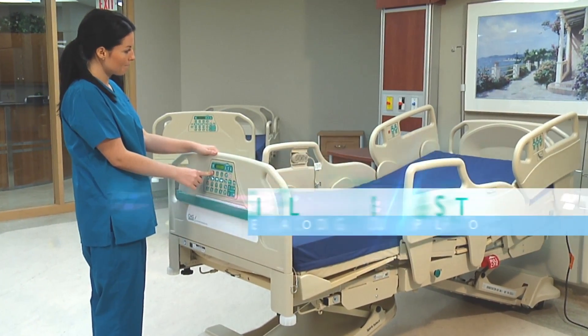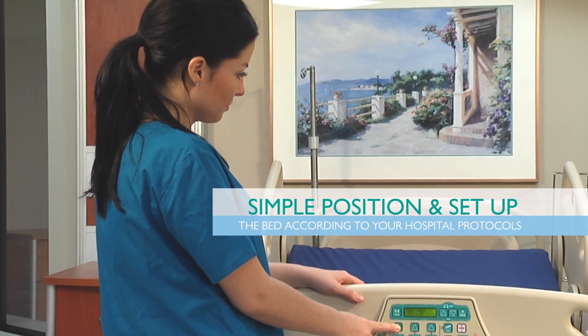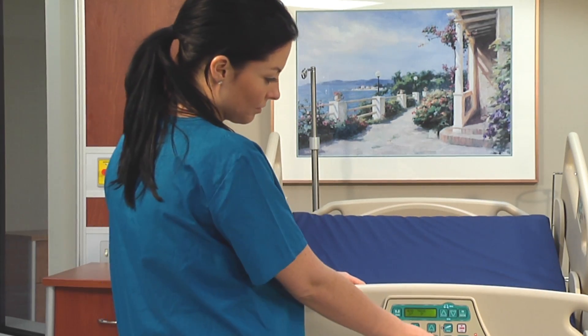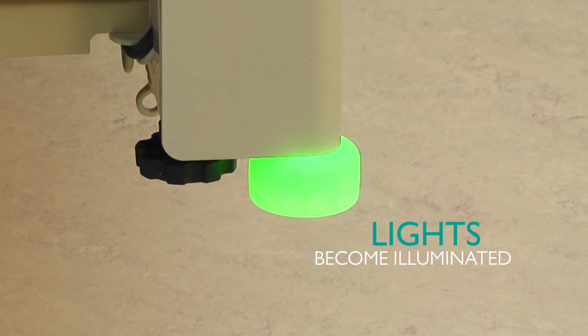To activate Watchdog, simply position and set up the bed according to your hospital protocols. This includes any patient lockouts or bed exit alarm settings that the patient requires. Press and hold the Watchdog button until the Watchdog lights become illuminated.